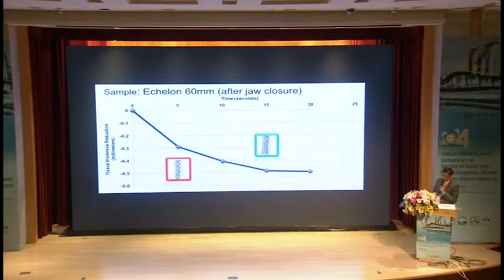So as you see in the graphic, tissue thickness changed until 15 seconds. Maybe we can think this is a teeny amount, but I just mentioned the highest staple gap is 2.3 millimeters, and 0.5 millimeter is a large number. If we can wait 15 seconds after the jaw closes, we can compress tissue by more than 0.5 millimeter additional.